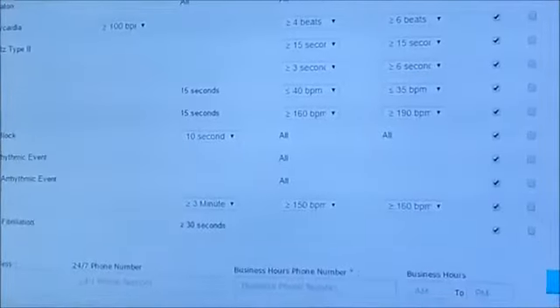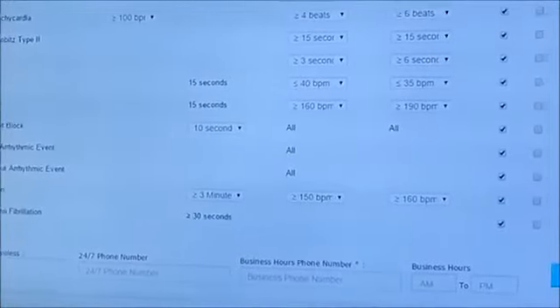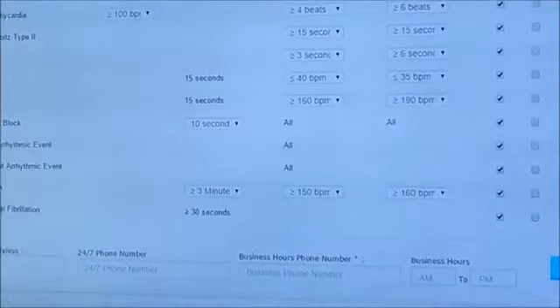If there is a call center setup where all the arrhythmias are monitored before it is seen by the doctor, because doctor will not be monitoring every time, there is a backend team required, which we call technicians, who will be seeing the arrhythmia detection and inform the doctor whenever a critical arrhythmia happens. Though our device is not an emergency response device, through this setup, if any critical arrhythmia happens, the technician can inform the doctor.